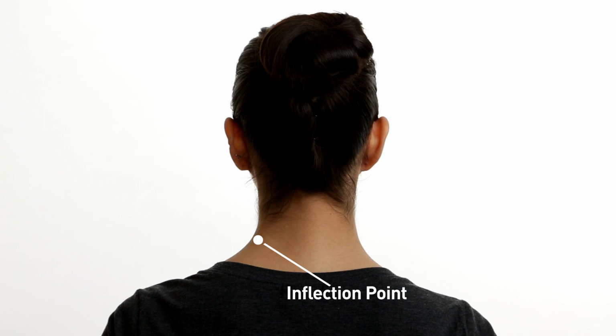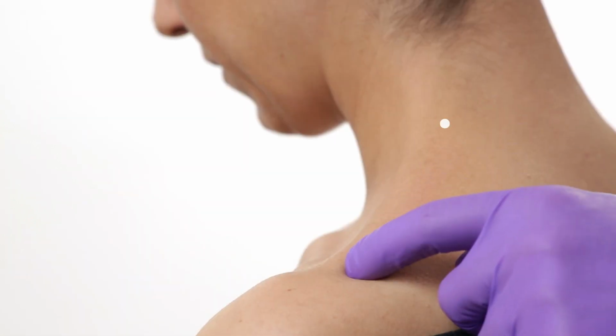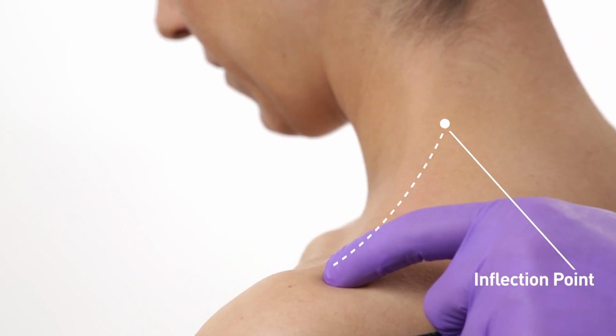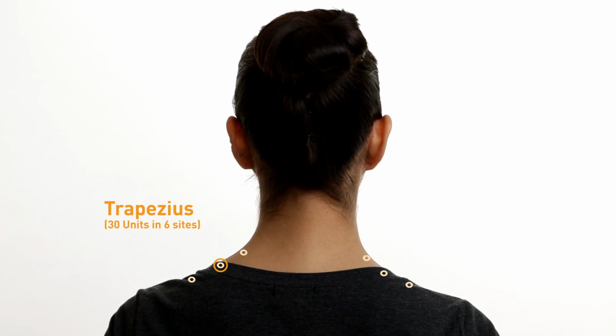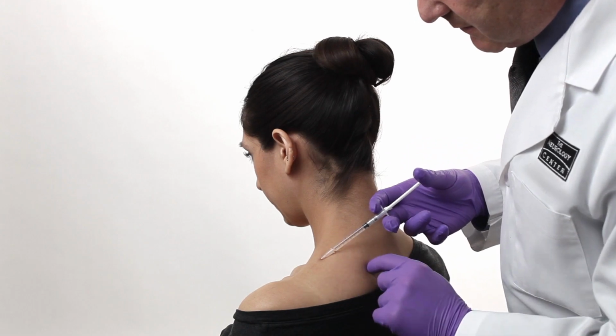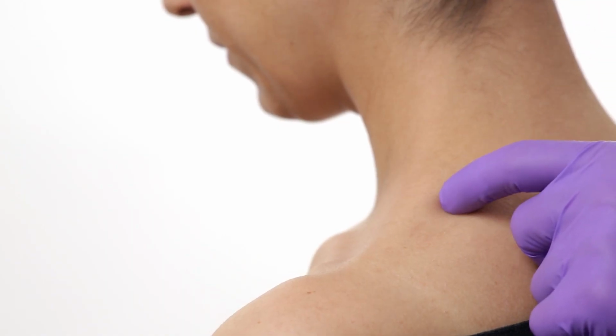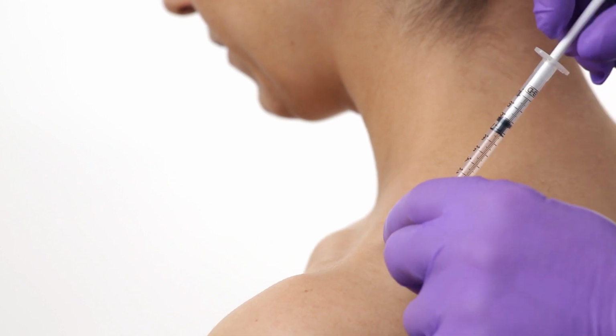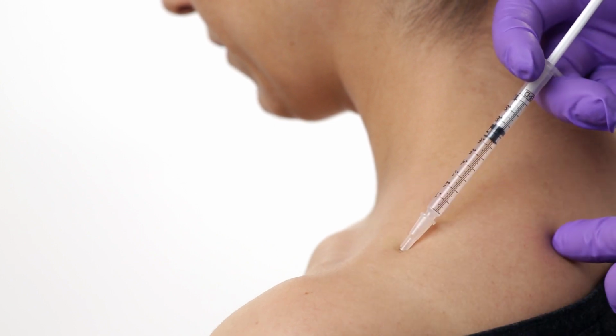The inflection point is where the trapezius muscle swings from a vertical line in the cervical region to a horizontal line in the supraclavicular region. Divide the upper portion of the trapezius muscle from the inflection point of the neck to the acromion in half. The first injection should be administered at the midpoint. Stabilize the hub of the needle and inject. For the second injection, move about 3 centimeters, or approximately 2 fingers breadth, laterally from the midpoint down along the trapezius toward the shoulder. Point the needle medially and angle it 45 degrees. Inject, making sure not to go too deep.